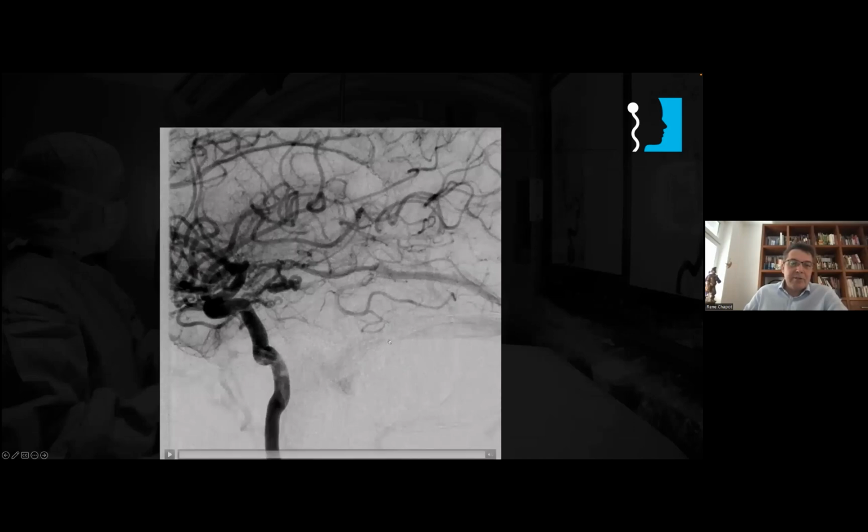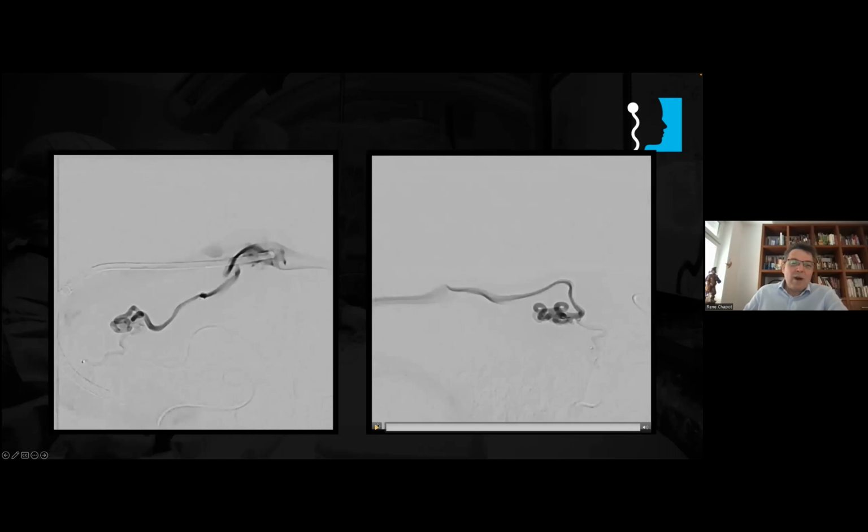Here is a rotational angiogram. And then after the rotational angiogram, we do selective angiograms. And here are the selective angiograms, where we put the microcatheter in the main feeder, where we see also the vein. So this seems to be quite simple. It's a small AVM, you've got a main feeder. And once we've been doing the rotational angiograms through the guiding catheter, then we make it also through the microcatheter here. And then we obtain this image here.